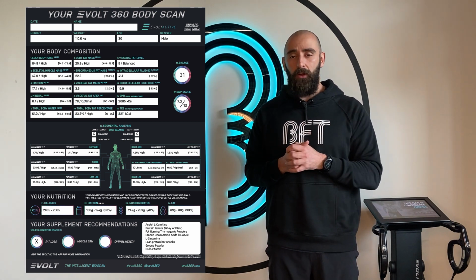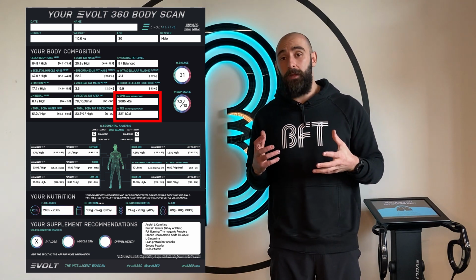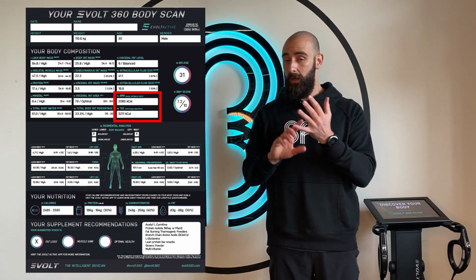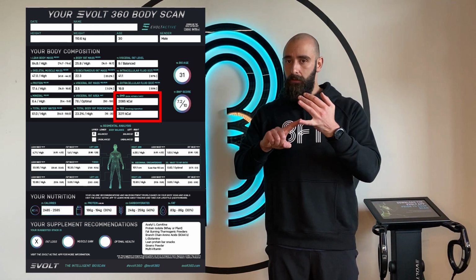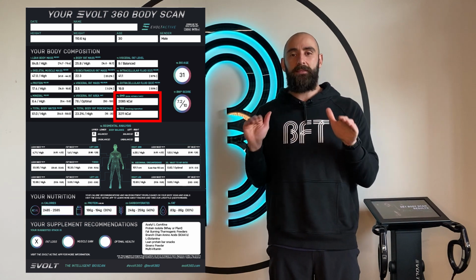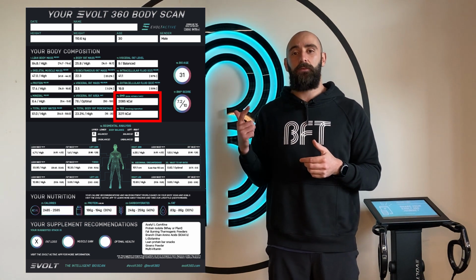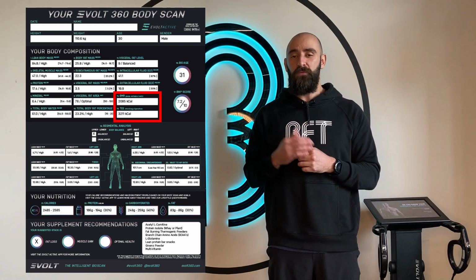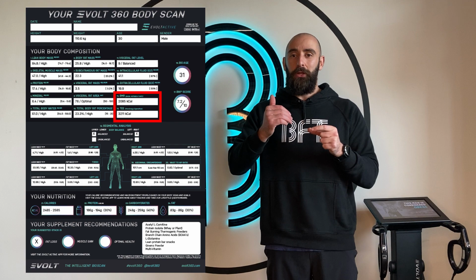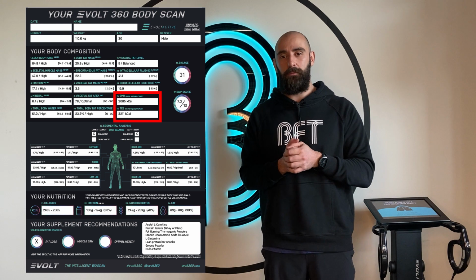A couple of other things we want to look at on our scans is where you've got the BMR and the TEE. So with the BMR, it stands for your basal metabolic rate. Basal metabolic rate is what your body needs for cellular function at a base level. So that is not even sleeping, that's comatose. So that is for cellular function, that's for brain function, that's for organ and liver function, for breathing, just base cellular function throughout the body. The second you open your eyes, you step out of bed, you walk down the street to get a coffee, you're burning extra calories. So that is going to be additional on top of your BMR. So when we are dieting, it's really important that we never go lower than our BMR, because that's a really good way to make sure that we're not going to get the nutrients or the energy and the fuel that we need to actually survive and to perform.